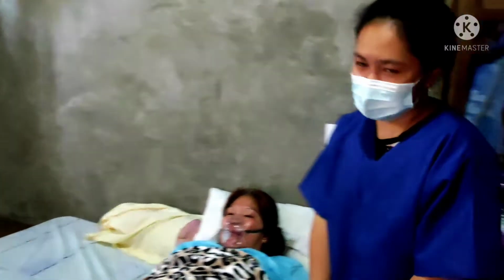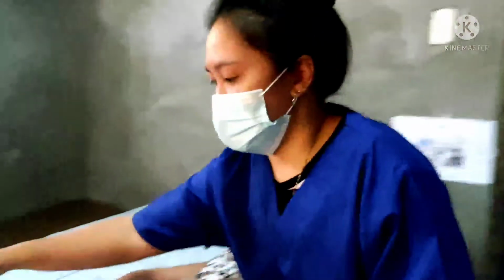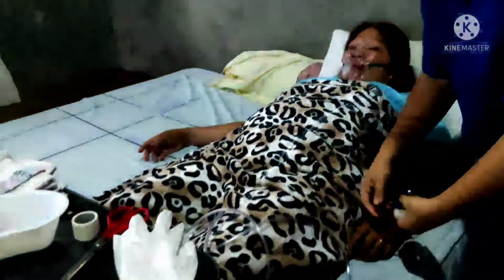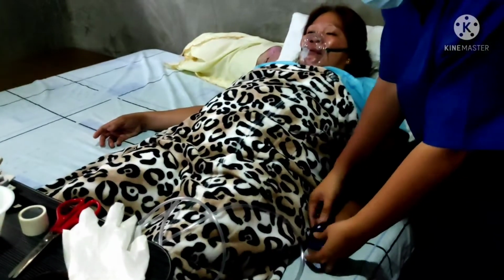Okay. Okay, thank you. So now apply a pulse oximeter to monitor his or her oxygen saturation level. So this is the pulse oximeter. Help the patient into semi-Fowler position or sitting position.